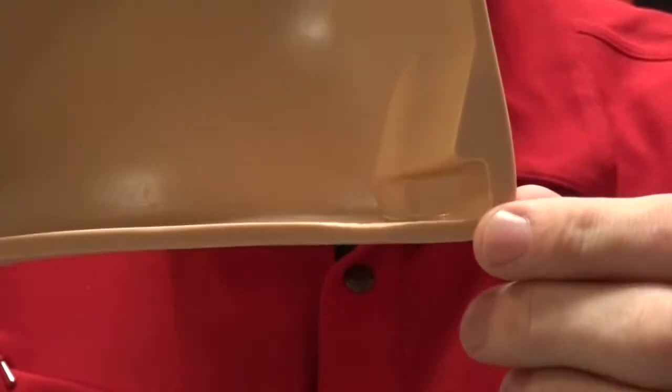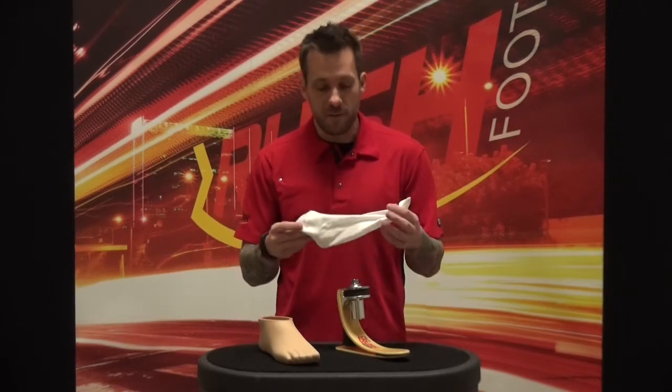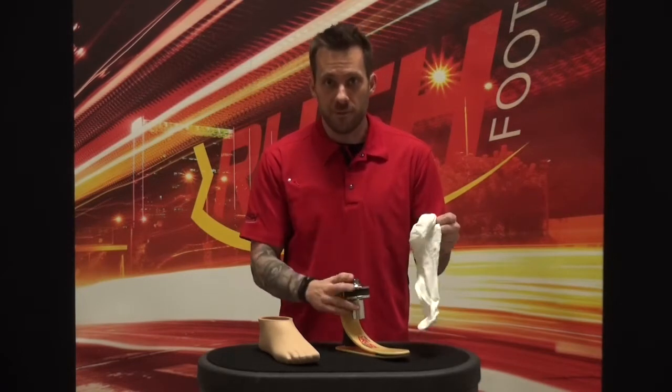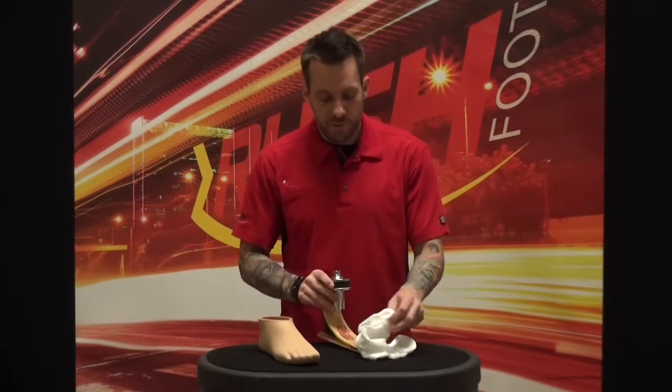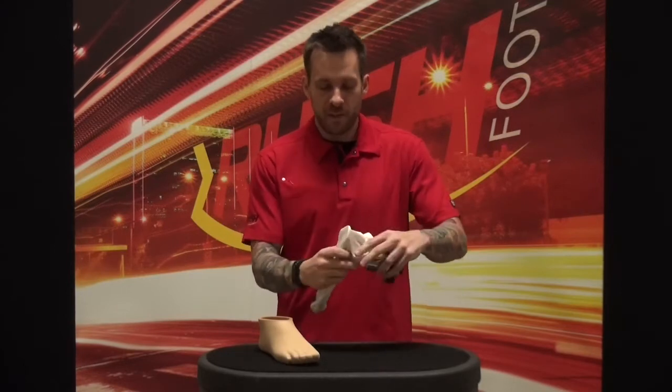Think of it as like putting a chain on a bike. You have to start it and then walk it on, and to remove it you have to take part off and reverse it off. Now that we're ready to try putting the foot shell on, the first thing I'm going to say is use a Spectra sock. Obviously we always use these because they protect the foot. They also help reduce friction as you are sliding that shell into place.